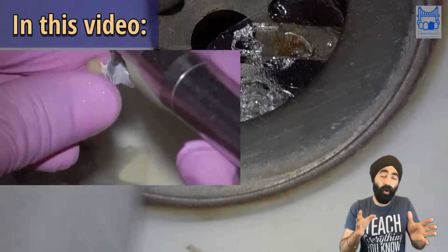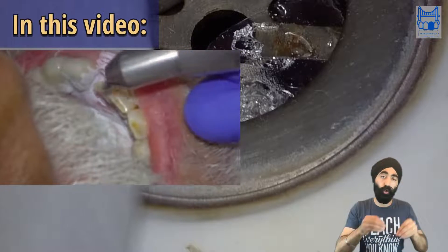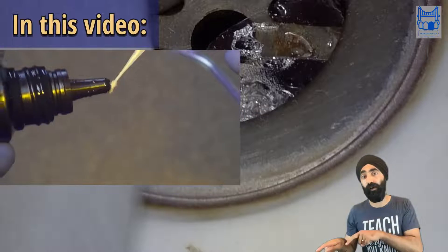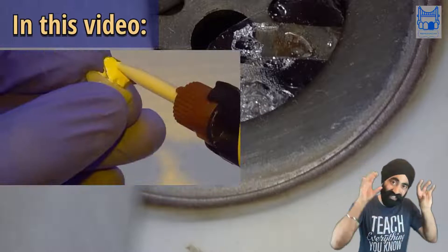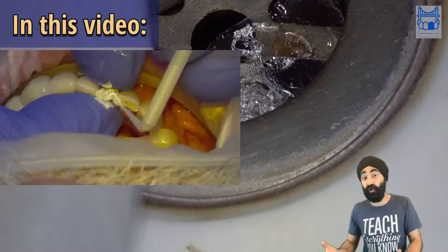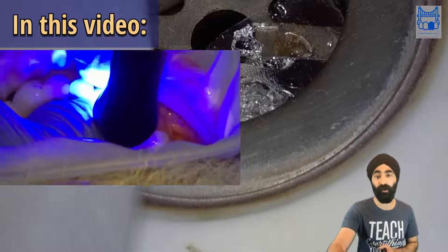Hi guys, my name is Jaz Gulati and in this video I'm going to show you the exact protocol I followed to re-cement a resin bonded bridge that failed. I'm going to give you the commentary of exactly what I was thinking at the time, what I was doing, and also talk you through some design features and tips and tricks when you're working with resin bonded bridges.